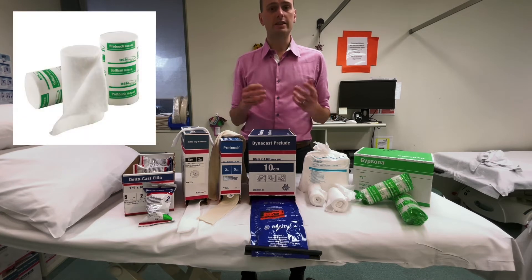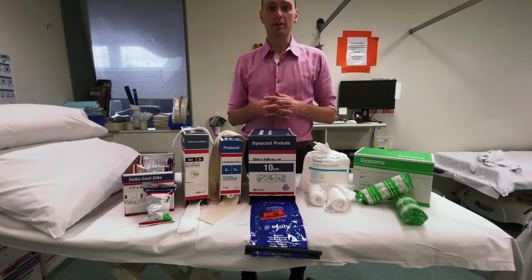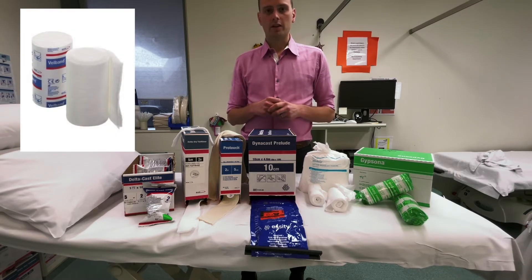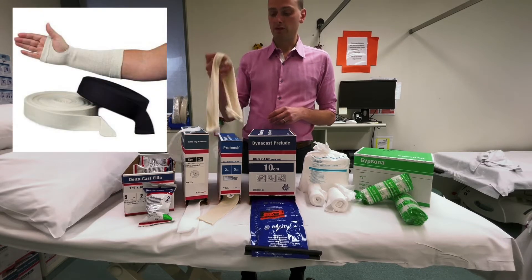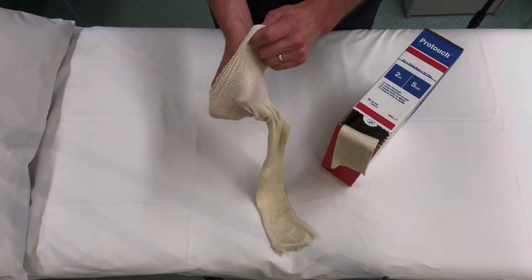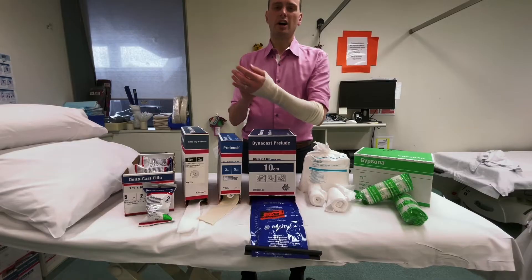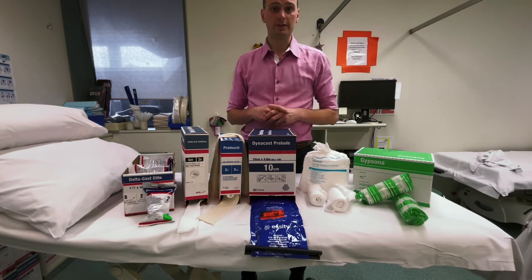The other options are Soffban, which is a synthetic version that is slightly thicker and perhaps holds reductions less well, and Velband, which doesn't tear so well. In plaster technicians' hands you might also see what's called under-padding or stockinette — a cylinder of material used to protect a whole limb in one easy placement. I typically don't see this used much in emergency departments or theatres, but it is used in fracture clinics, for example.